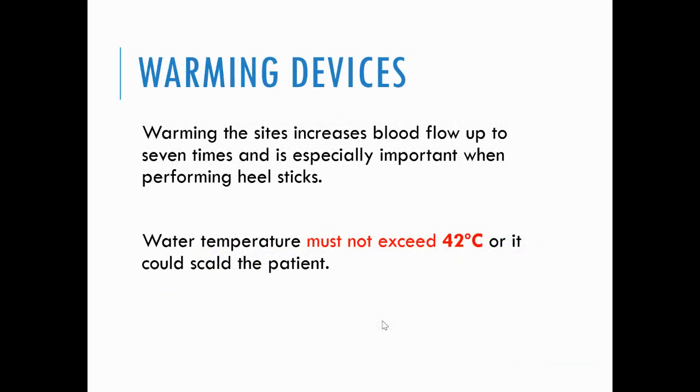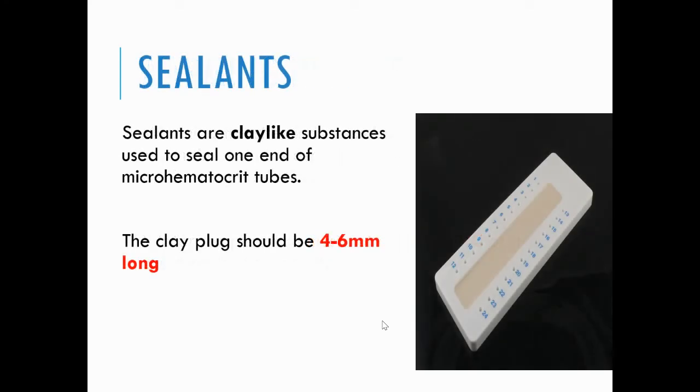Warming device. So we need to warm the area to increase the blood flow. And also, water temperature must not exceed 42 degrees Celsius or it could scald the patient. So we have sealants. So, ginagamit ang sealant kung atong gina-seal. So i-seal gud nato ang capillary tube para dili mugawas ang dugo sa capillary tube.